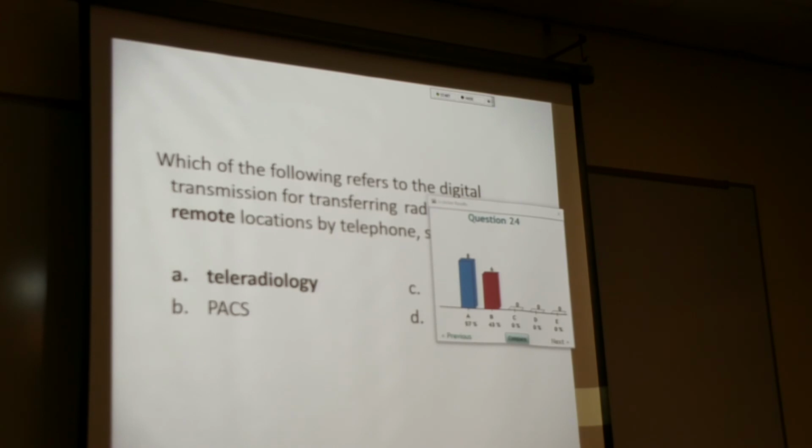So I remember the first time we remotely sent an image to a radiologist at home. And we put an X-ray film, the X-ray image on film, on an overhead projector that was hooked up to the phone system. An overhead projector. Okay, can you imagine what that looked like? Like crap. It was horrible. But we were fascinated that that could be sent. Well, the radiologist didn't like it. It didn't last long. But I remember that first time.